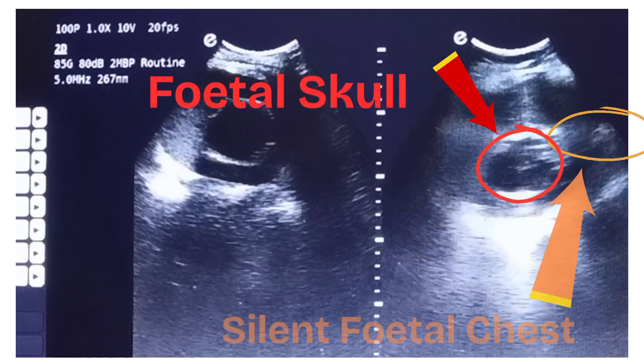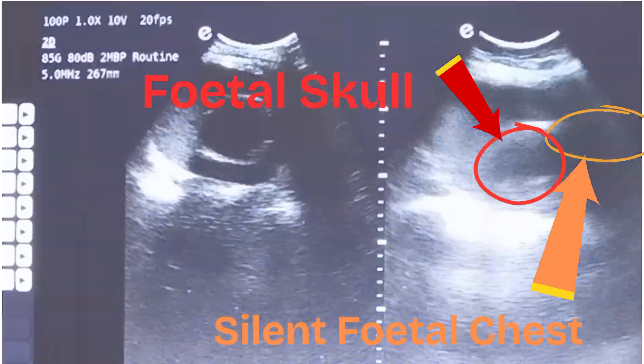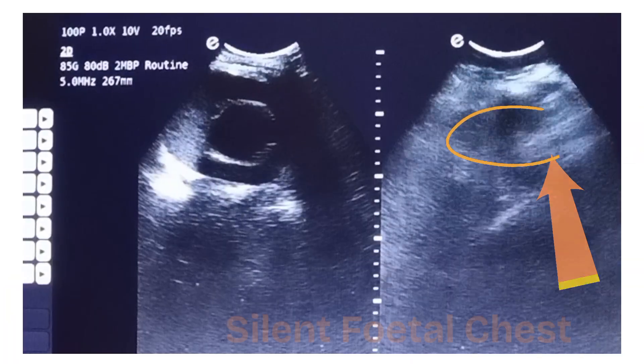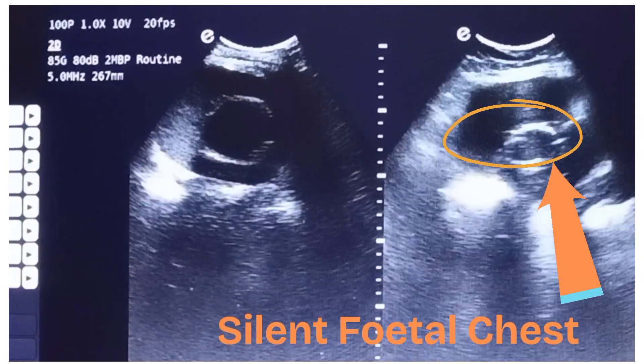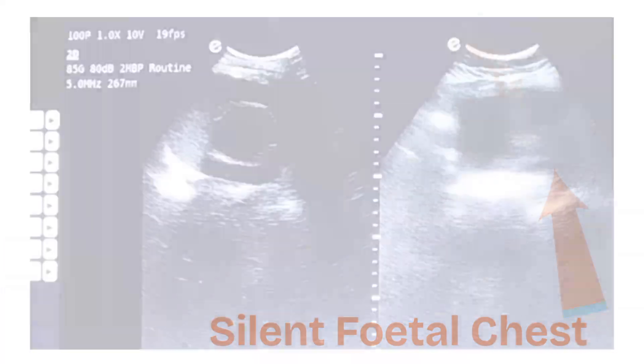Here the yellow circle shows the fetal chest, and the fetal head can be seen inside the red circle.